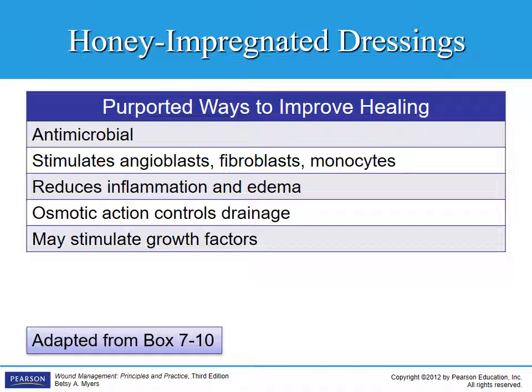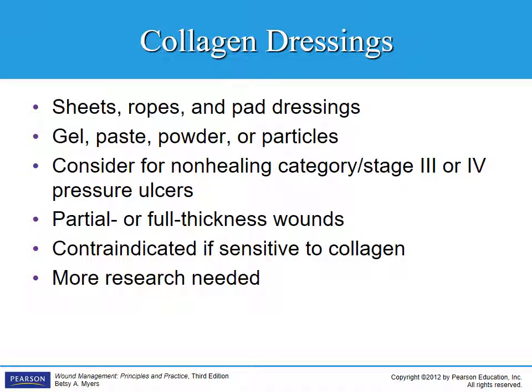It is antimicrobial. It stimulates angioblasts, fibroblasts, monocytes. It reduces inflammation and edema. There's an osmotic action that actually controls drainage because of the action that it has with the actual cells on the wound bed. And it may also stimulate growth factors, and this all has to do with the honey itself. It says here, as you see, purported, there is some research on it. It's fairly new. The research that's out there so far is pretty good for honey impregnated dressings.